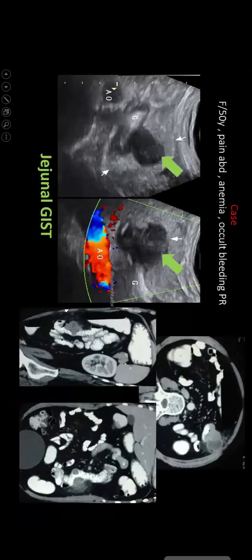So these tumors basically have exophytic components. They involve the stomach, small bowel, smooth muscle tumors. They are frequently very large, and may undergo ulceration, degeneration, necrosis, and hemorrhage. On ultrasound, we can see a rounded, exophytic, dumbbell shaped mass of variable echotexture. Central cystic area shows hemorrhage and necrosis. This patient has a rounded exophytic mass with mesenteric extension.